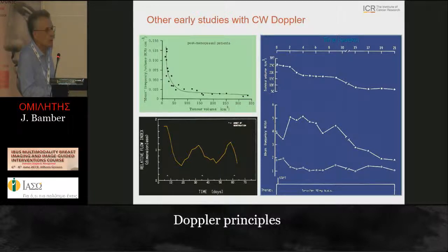And that prediction is based on a model that is only a sphere of a given diameter that corresponds to the tumour volume. The model just assumes that the vasculature is only distributed on the surface of the sphere, as if it was just centered around the vascular rim of the tumour. And look how good a fit it is, suggesting that in this series of breast tumours, most of the vasculature was concentrated around the rim of the tumour, which is not surprising because that's the advancing, growing edge of the tumour. It needs the blood supply. That's where all the cancer cells are rapidly multiplying as it invades the local tissue.